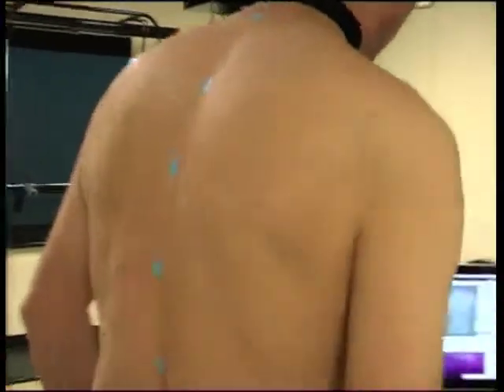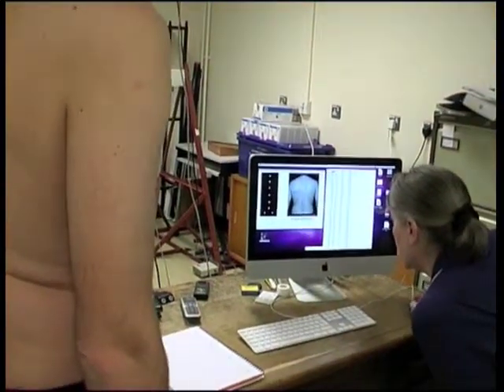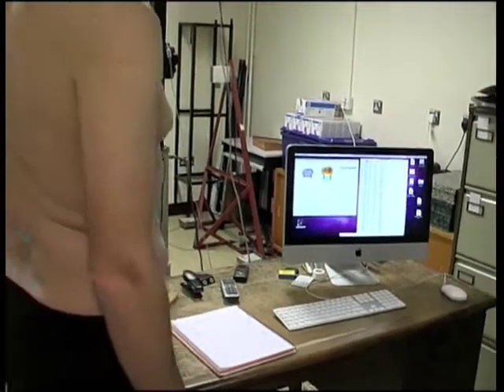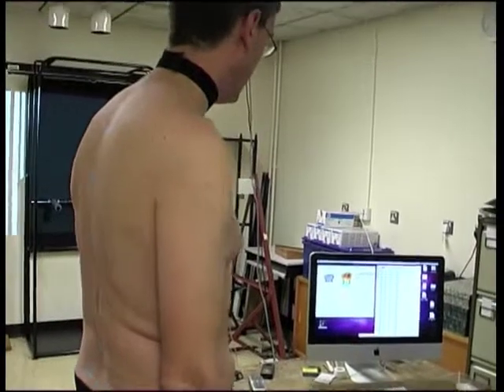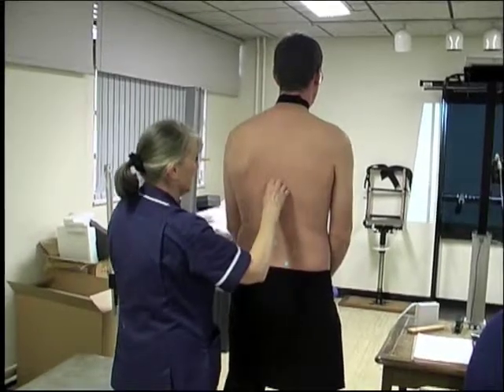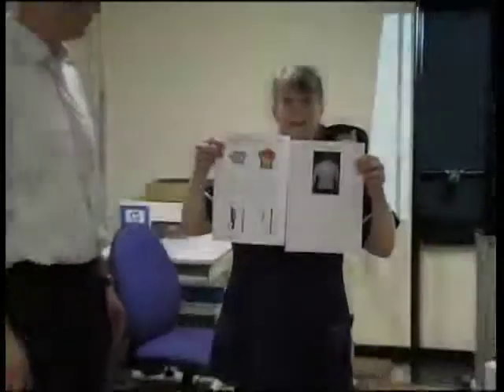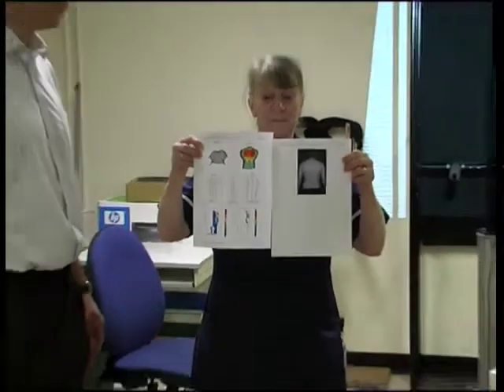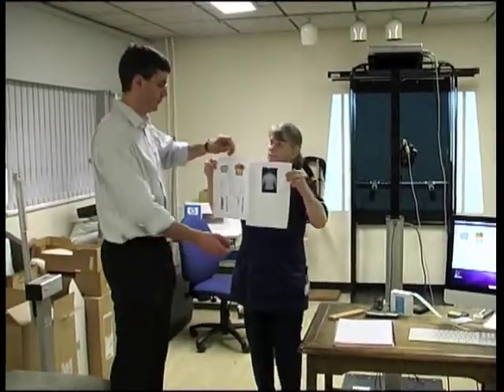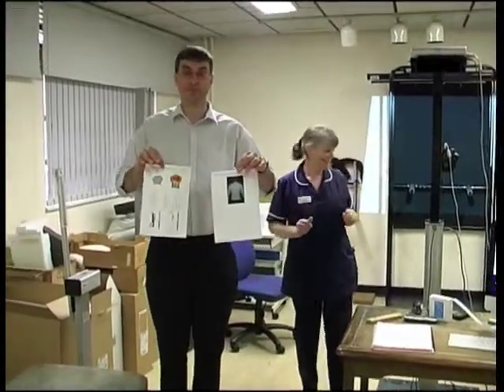If you want, you can watch the analysis. We confirm that the stickers have been located correctly, and then the computer calculates the clinical values and stores all the data in the database. Then we remove the stickers and you can get changed into your normal clothes again. These are the results sheets — you will be given a copy to take home with you. The whole procedure is normally carried out in about 10 minutes.